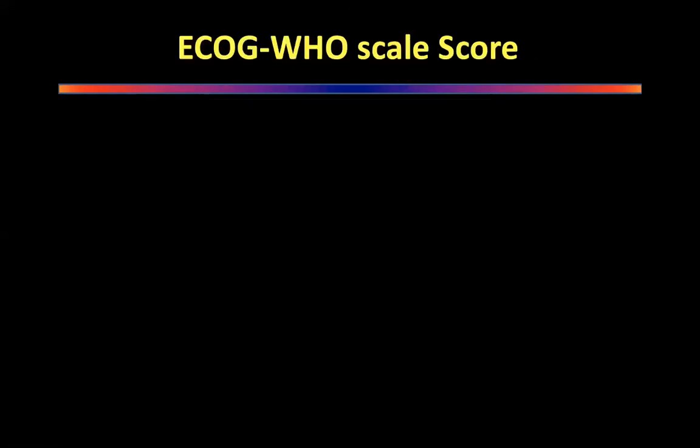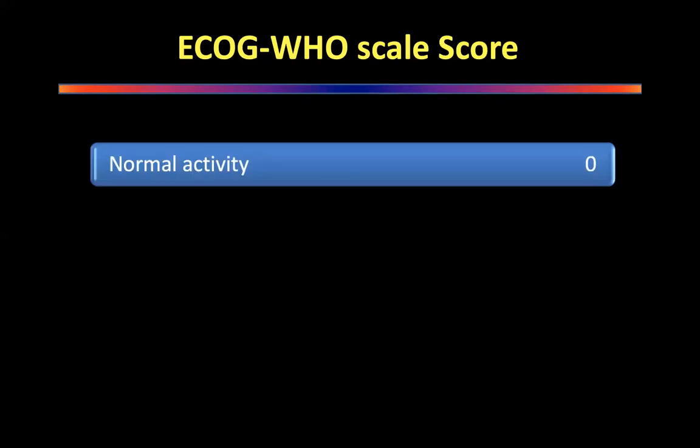Okay. What is split function in this chart, sir? Same thing, FEV1, DLCO. That is a split perfusion. Yeah. Okay. What about ECOG and WHO scale?